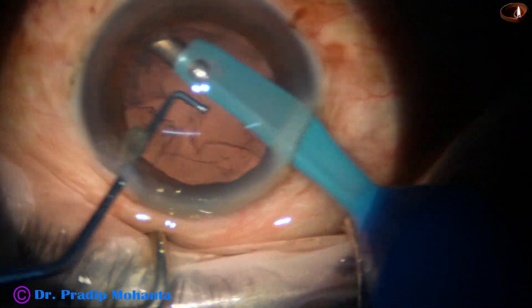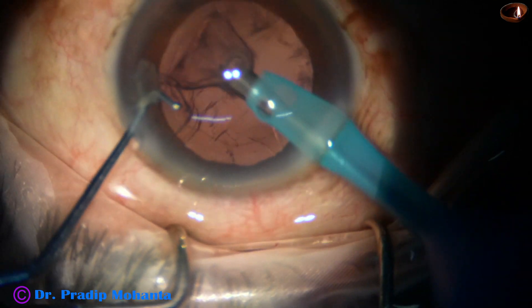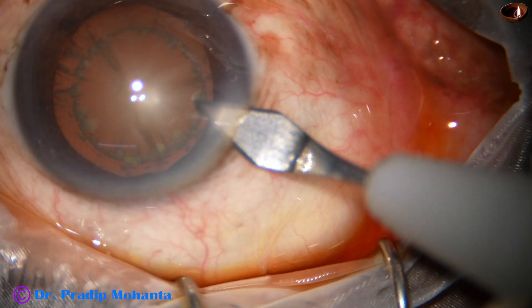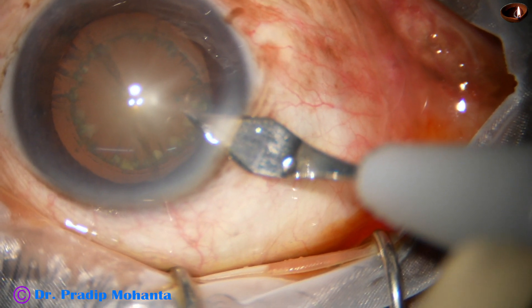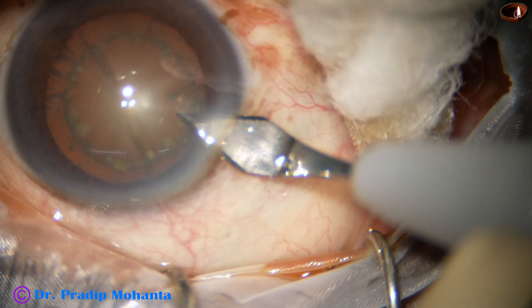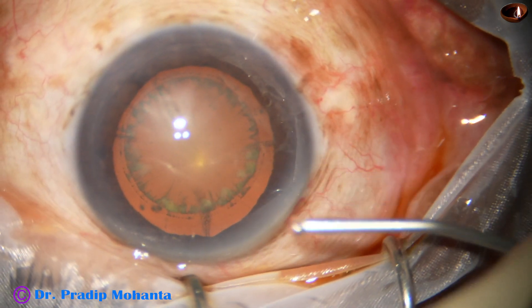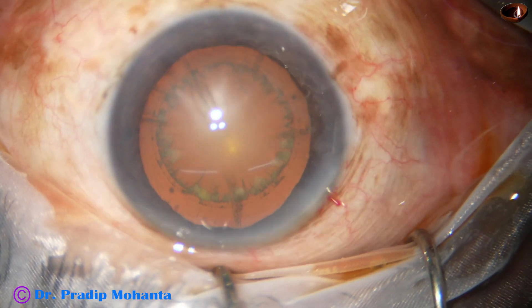Dear colleagues, the main emphasis of this video is to show you the use of reflux. It's a very important reflex that we must develop. All phaco surgeons must train their foot to such an extent that even if you catch the posterior capsule, you should be able to stop in time, use reflux, and release the capsule. If you can do that, you will not tear the posterior capsule and the patient will be blessing you throughout life.